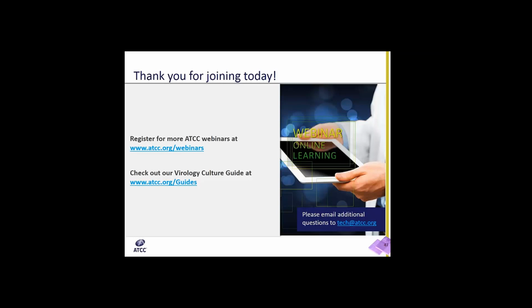Our next question is, how do I check for mycoplasma contamination of cultures in my lab? There are several PCR-based detection assays that are commercially available, and you can perform the test yourself. ATCC also offers the universal mycoplasma detection kit, which you can purchase via our website.